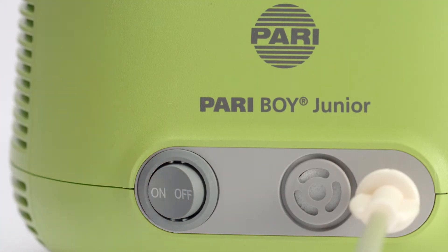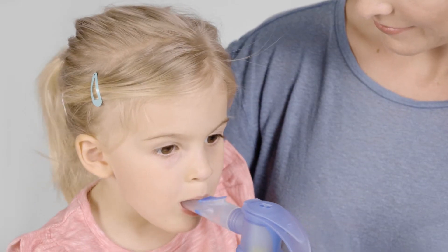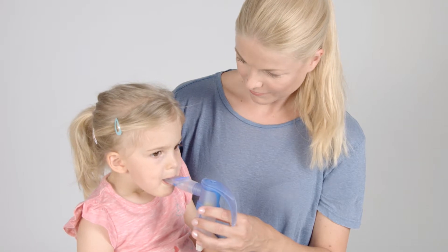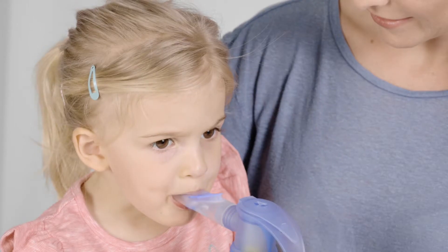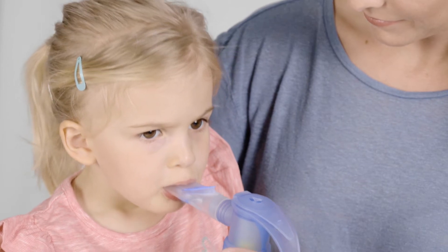Switch on your device and have your child hold the mouthpiece between his or her teeth; the child's lips should close around it. Have the child breathe in slowly and deeply. If your child inhales too quickly, the PIFF control system generates resistance and emits a brief soft sound. As soon as you notice this, have your child briefly stop inhaling.